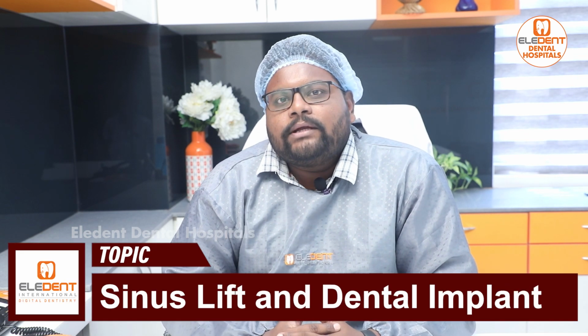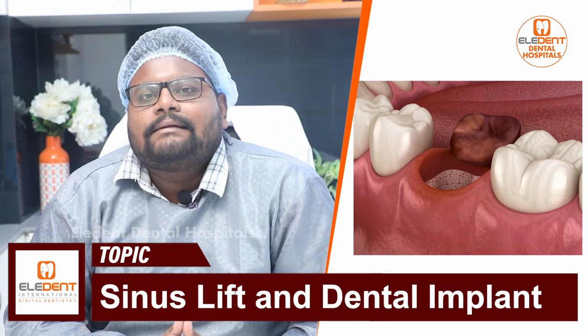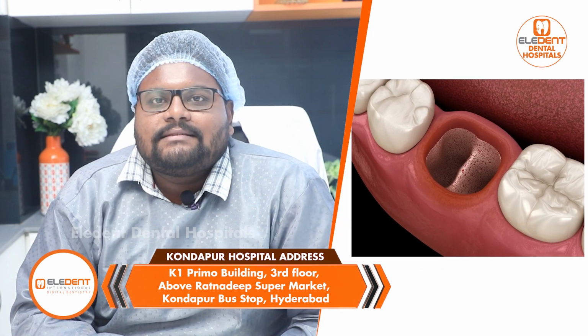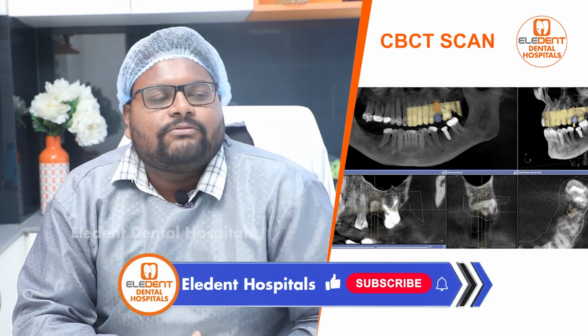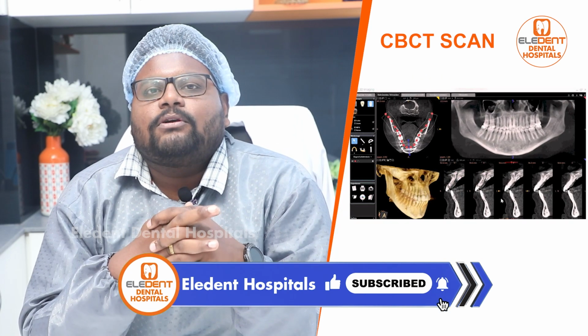Today the topic that we are going to discuss is sinus lifts. Whenever a patient visits a dental clinic for replacement of a missing tooth, the doctor often suggests, after taking a CBCT, that along with the implant, a sinus lift procedure is necessary. This CBCT is basically a three-dimensional simulation of the bone that is there, and it shows every millimeter of a cross section of bone available and the vital structures associated in that particular region. Accordingly, the doctor will decide if a sinus lift is required or not.